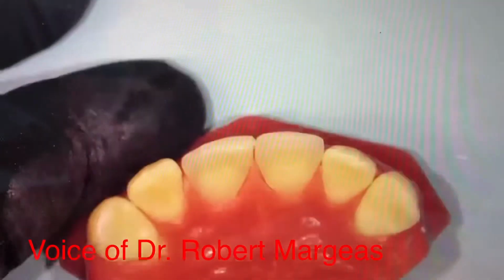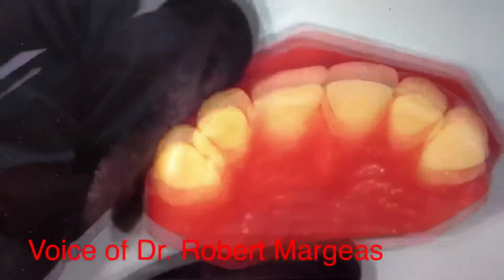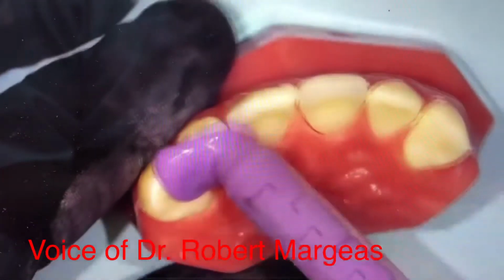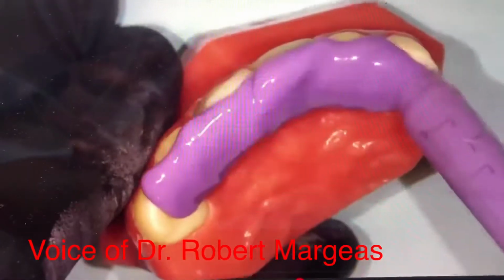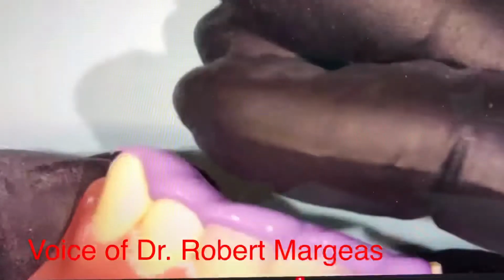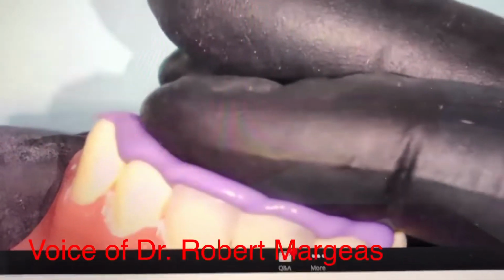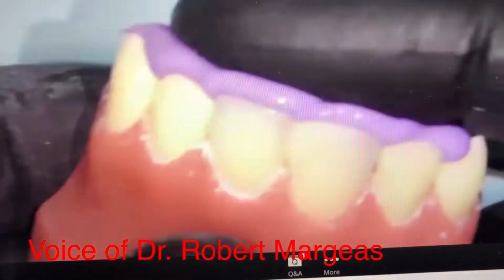So when I'm doing this in the patient's mouth, the important thing to remember is you really want to get the incisal edges for sure of the tooth. So I'm going to inject this material like this. And I can take my finger and literally hold that right there. I want to make sure that I get at least the facial incisal line angle of the tooth.